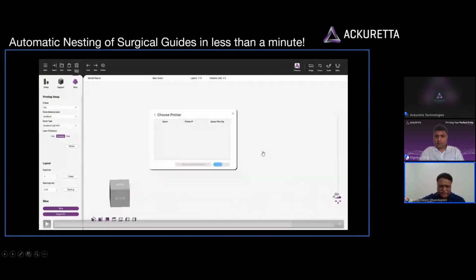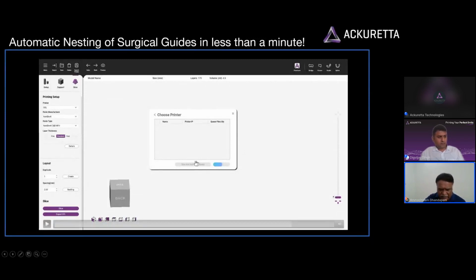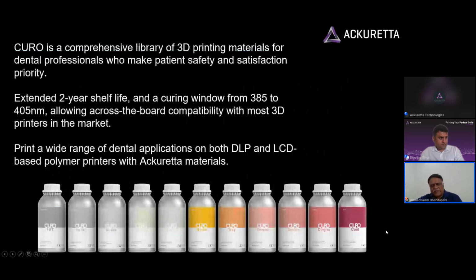Most of our printing is done bottom up, so we can see the sequence in which this is run and make sure that each slice or layer is well supported with an adequate number and size of supports. Then it's just a question of starting the print. There is a printer queue into which you can send this, and then you can set the print out.